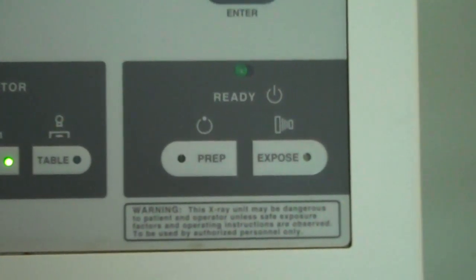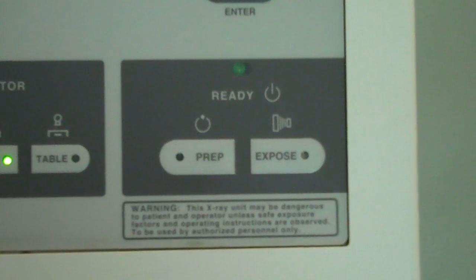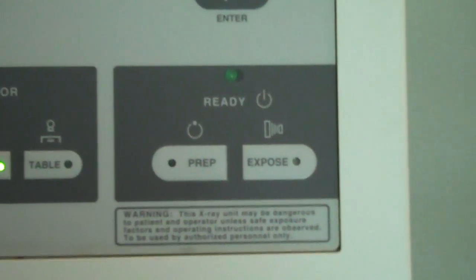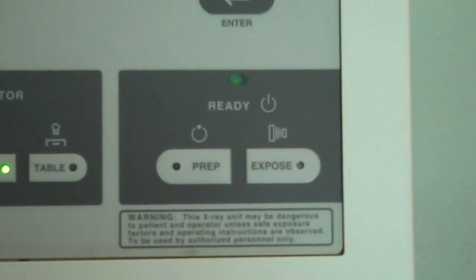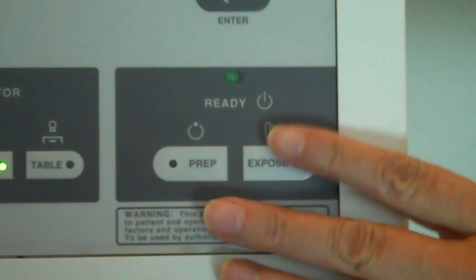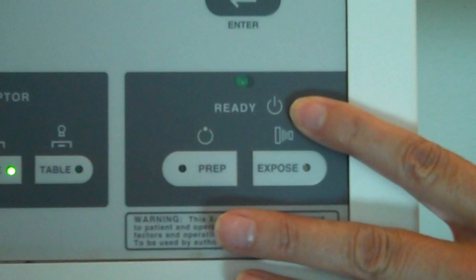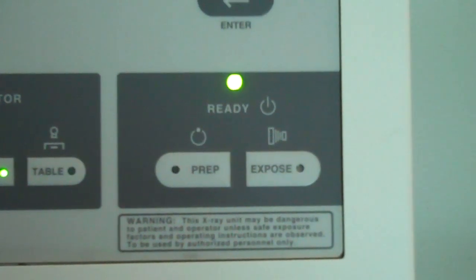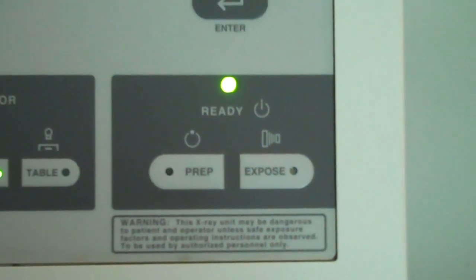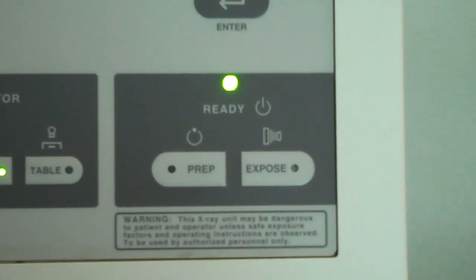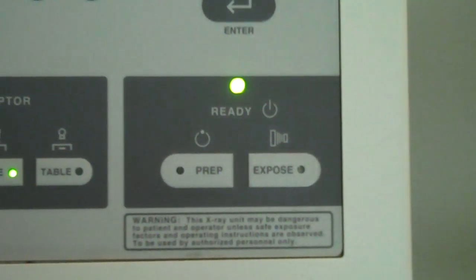When you're ready to take your exposure, make sure the door is closed. As you can see, the ready light is not on. When you close the door, the ready light will activate.